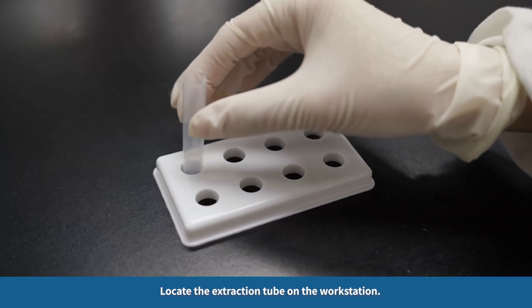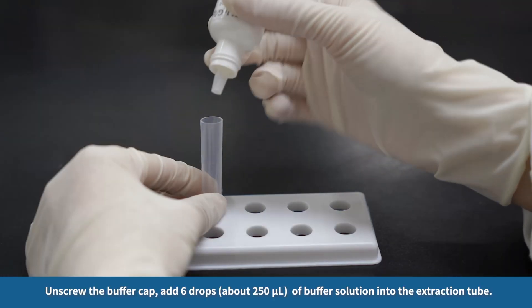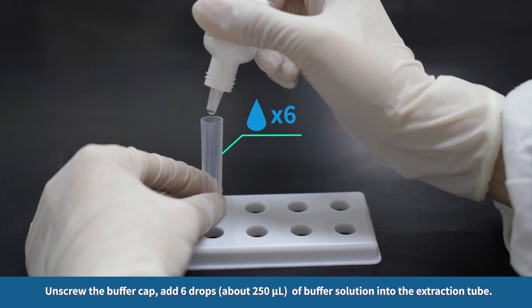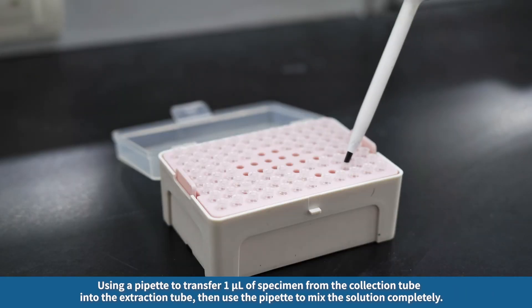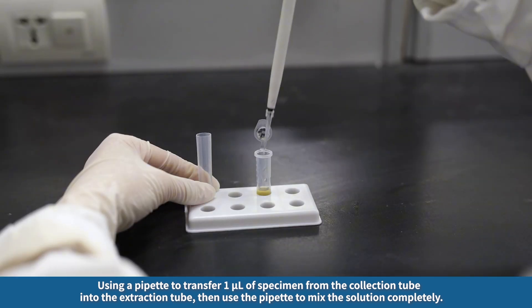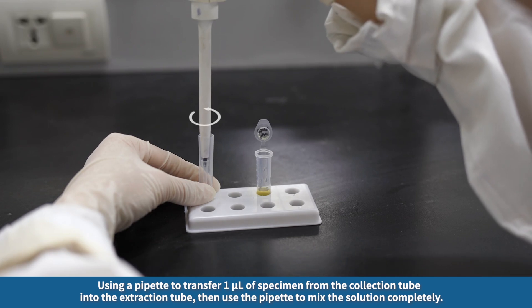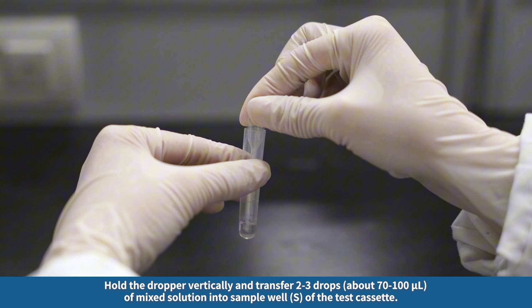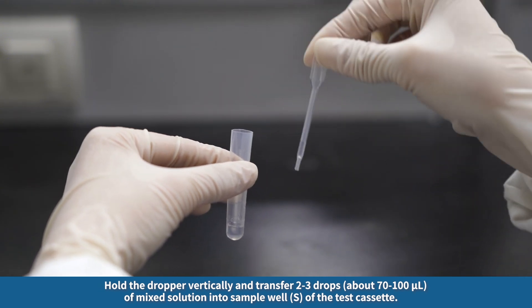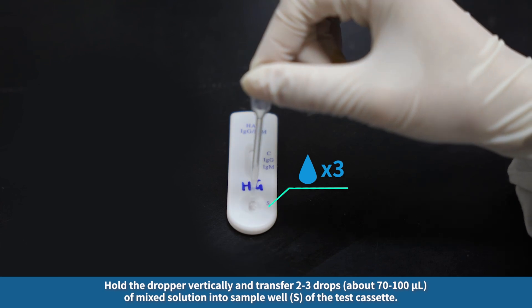Locate the extraction tube on the workstation. Unscrew the buffer cap and add 6 drops — about 250 microliters — of buffer solution into the extraction tube. Using a pipette, transfer 1 microliter of specimen from the collection tube into the extraction tube, then use the pipette to mix the solution completely. Hold the dropper vertically and transfer 2 to 3 drops — about 70 to 100 microliters — of mixed solution into sample well S of the test cassette.